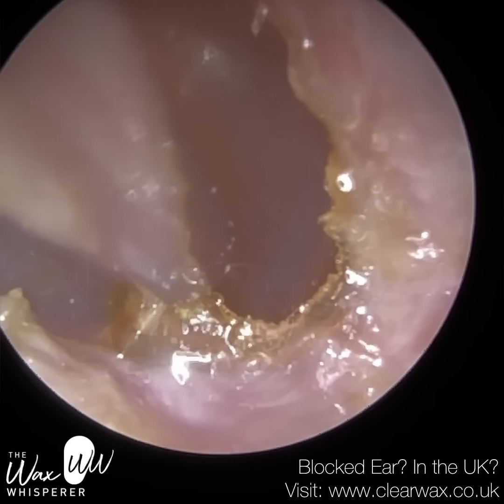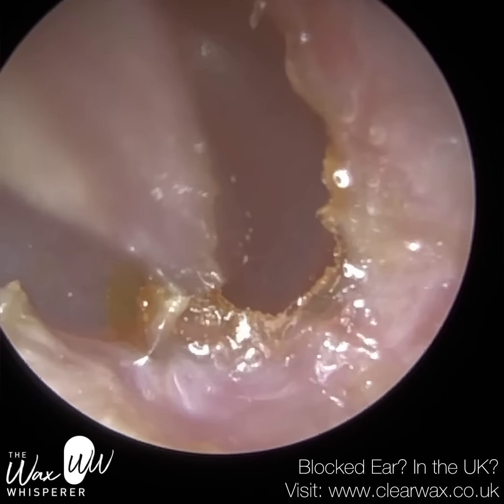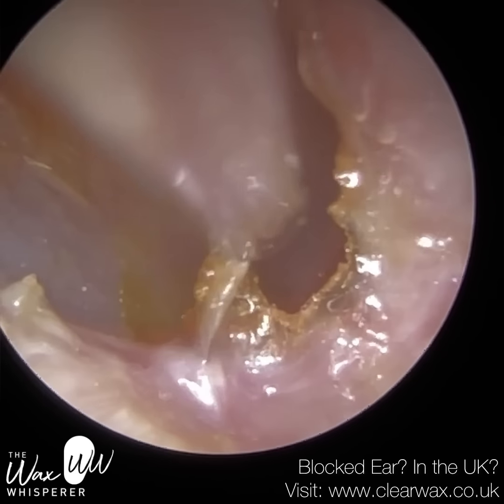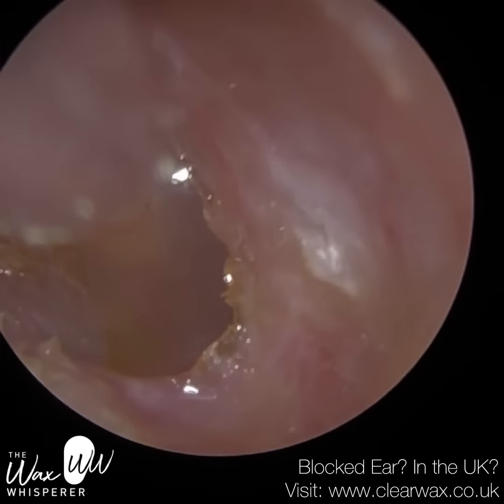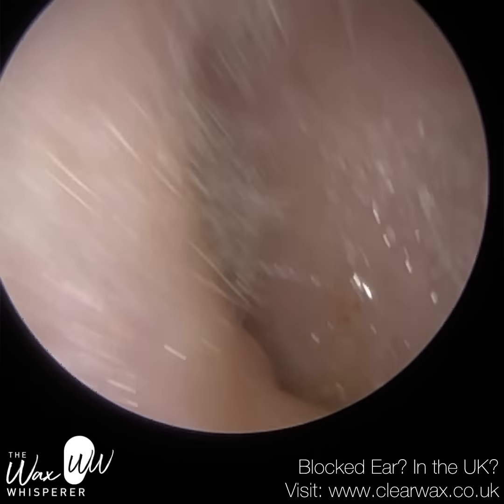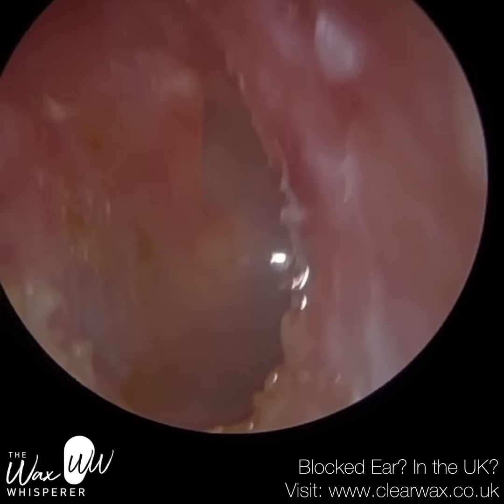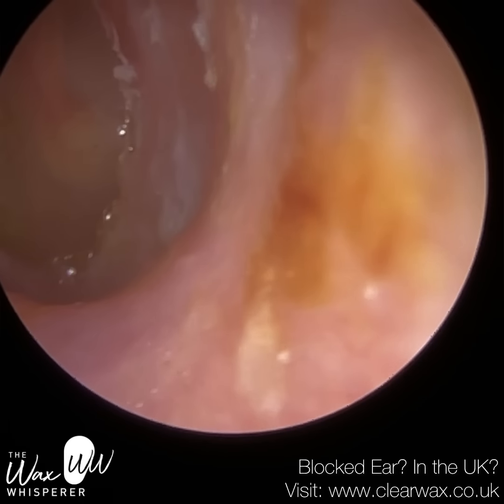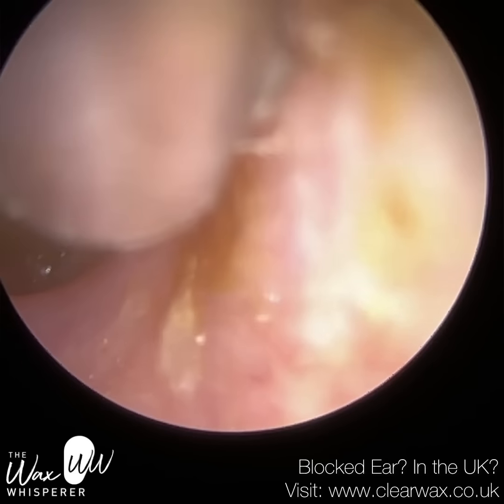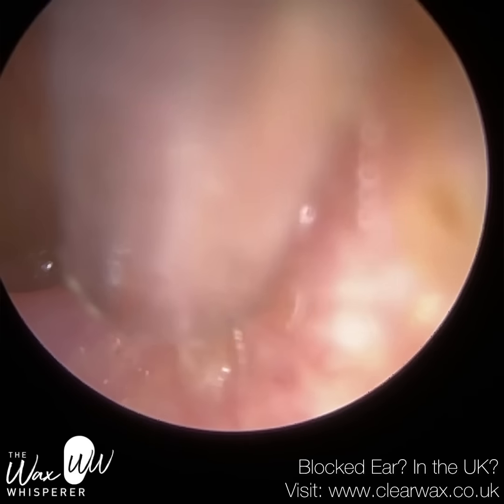Quite often patients with keratosis obturans can have a thickened eardrum. They have additional keratin on the outer epidermis layer, because the outer layer of the eardrum is made up of the epidermis layer, which is the outer layer, which also lines the ear canal. So there's some bruising there. The impaction is quite severe, and it's also where some granulation tissue was.